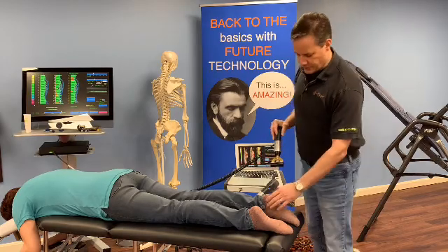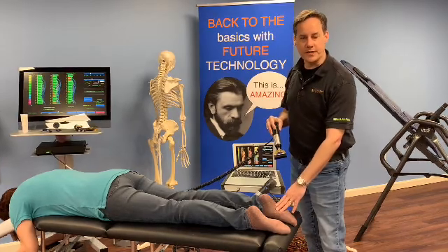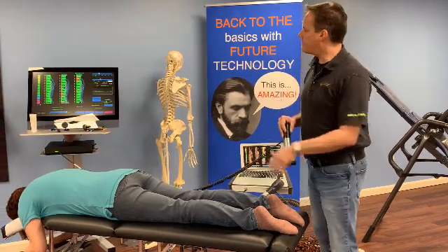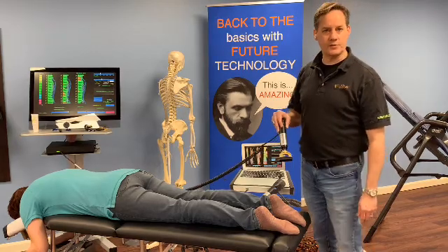Today I wanted to show you how we can work with extremities, in this case plantar fasciitis. Here we have one of our soft tissue tips that we can use with the system. I've set the Polestar up to the adjust mode at 15 pounds in the myofascial mode.